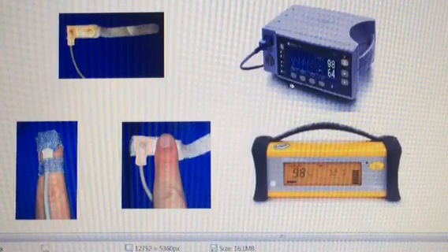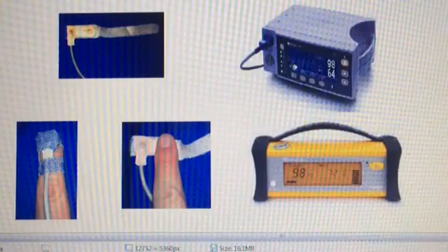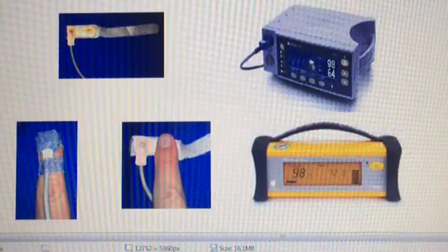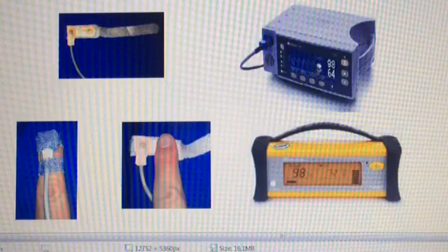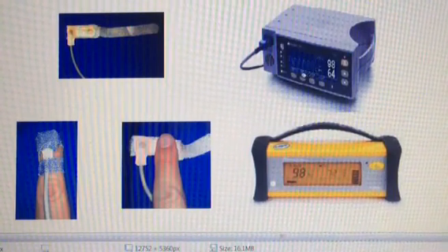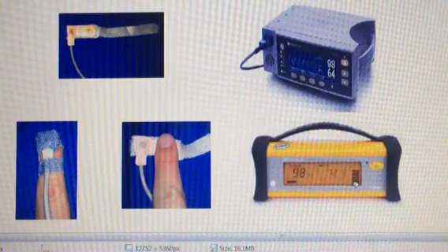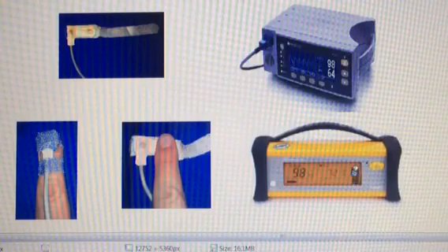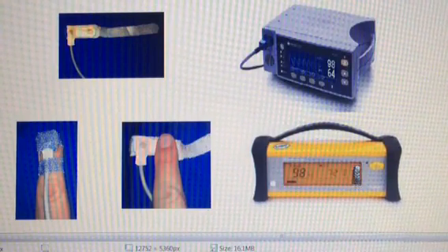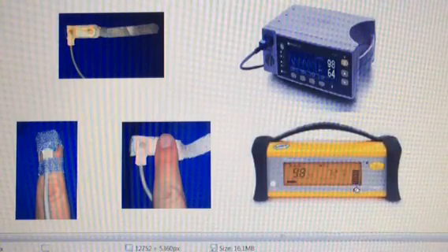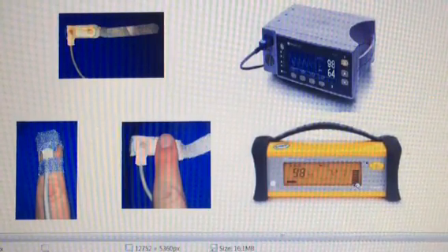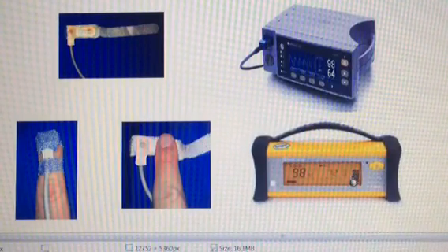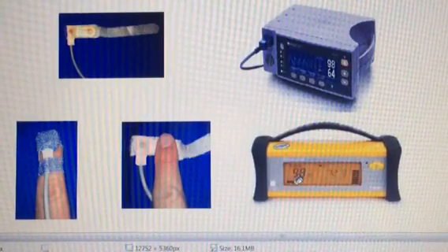If your patient is on a monitor in ICU, you should see a waveform like this one. It needs to be a nice, steady rhythm where it's picking up the pulse swell. If it's in a machine like this, the LED light will rise and fall with each heartbeat. And the higher it goes, the better the signal is getting. The pulse oximeter has to have a good signal for you to rely on the reading of the oxygen saturation.